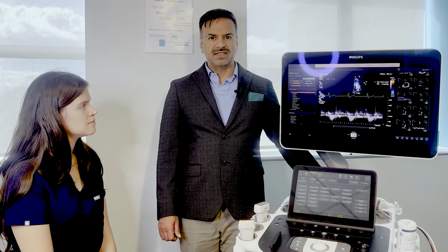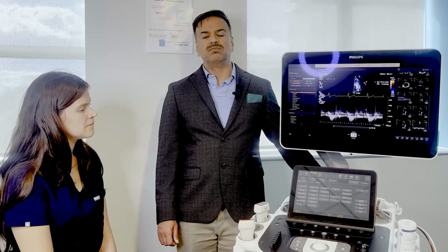There are a few basic measurements and image acquisition protocol parameters that should be acquired in everyday patients, which we acquired today. Today's patient did not have significant pulmonary hypertension, but we still looked for things such as the tricuspid regurgitant jet to assess pulmonary artery systolic pressure. We still employed the eccentricity index, and we also looked at TAPSE as well as chamber dimensions.